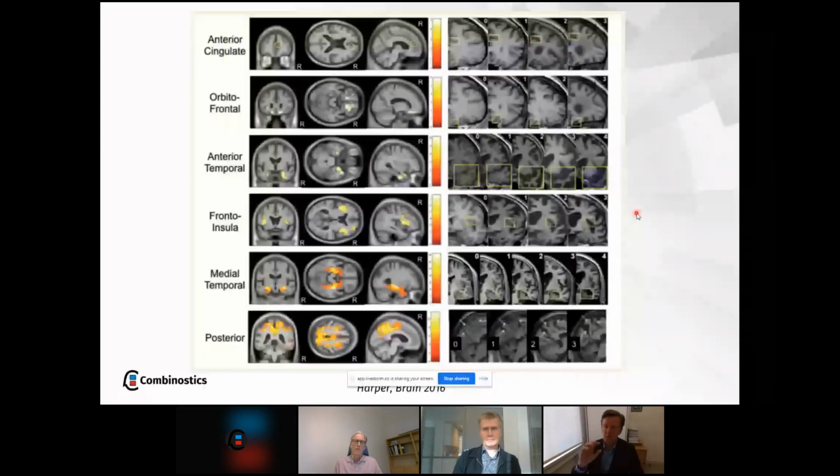In the postmortem study that I just described to you, we also looked at the correlation between various rating scales and the amount of gray matter that was left in the brain. There have been a couple of scales described to look at frontal atrophy. I'm not going to go into them in too much detail. They're illustrated over here. Sufficient to say that they do correlate with the gray matter density in the appropriate region, but some of them only very weakly, so they're probably not very useful.